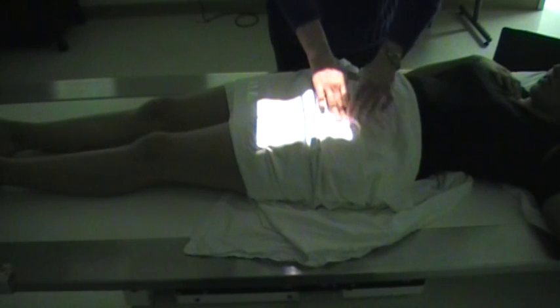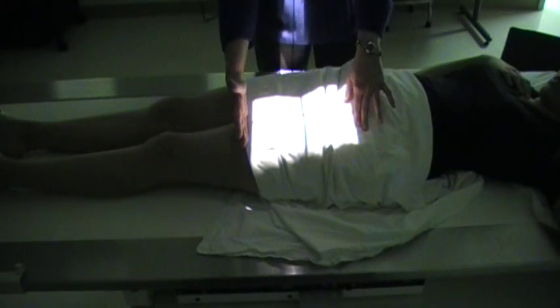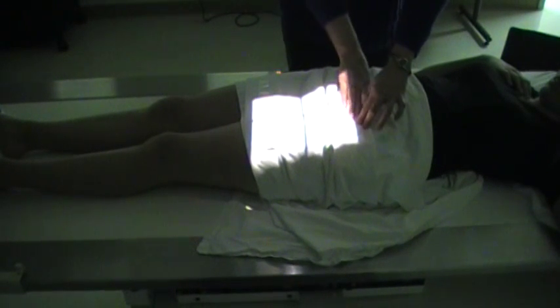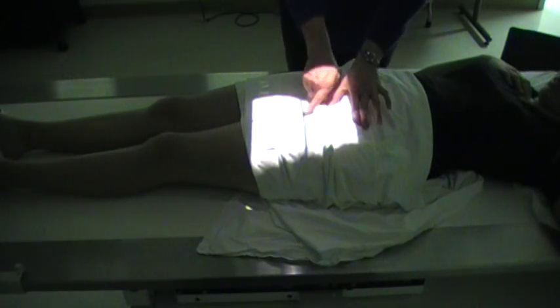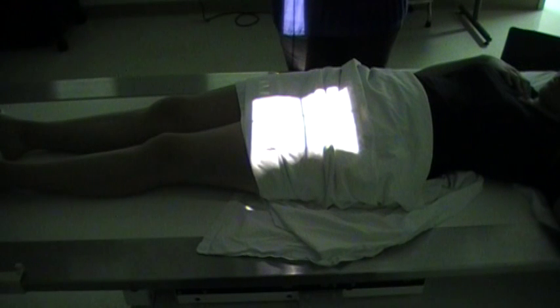Now, when you palpate the ASIS, if you put the top of the light field at the ASIS, and we have a 10 by 12 light field, it's going to have the proximal portion of the femur on here. It will also include the hip joint. And if you want to double check, you can draw your imaginary line from the ASIS to the pubic symphysis. Okay, and then you're going to go down about 2.5 inches to be at the neck of the femur. So this is our AP of the proximal femur.